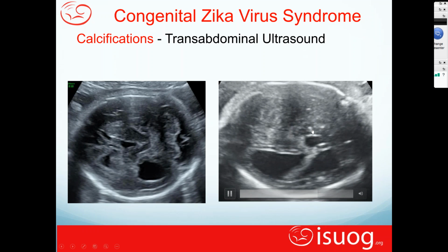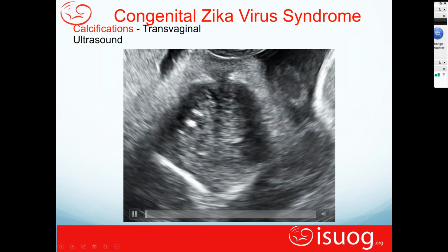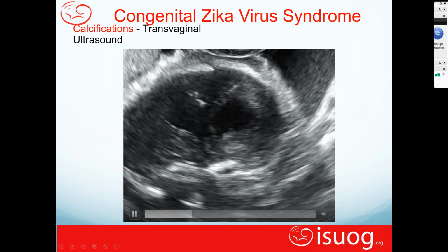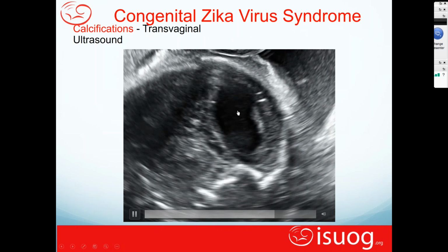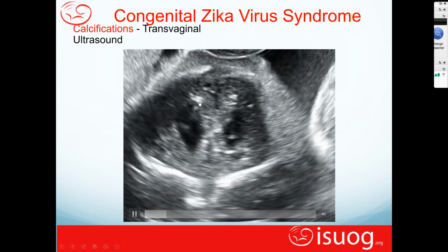Here's calcifications in transvaginal ultrasound, just to show you the remarkable differences that you see in the image quality that are there. Here's another example, transvaginal, seeing the changes in the ventricular system, as well as some of the calcifications that you can perceive right there on the image that we can see very candidly.